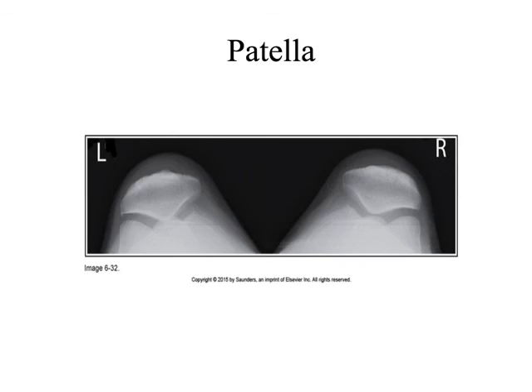So like 4-view, 5-view knee. Some institutions have this included. Do they do these at any of the places y'all are at? Okay, good. Yeah, fairly common X-ray for the ER.